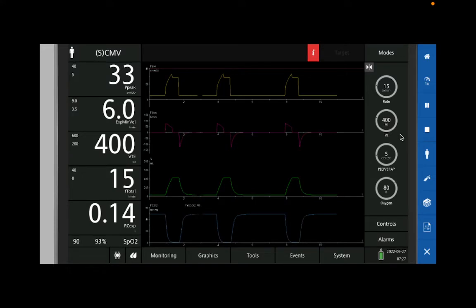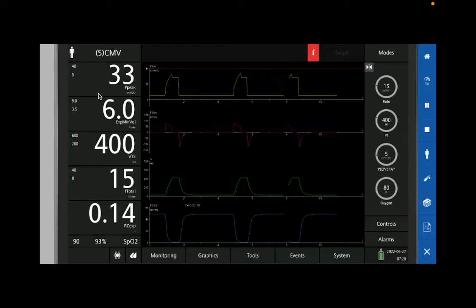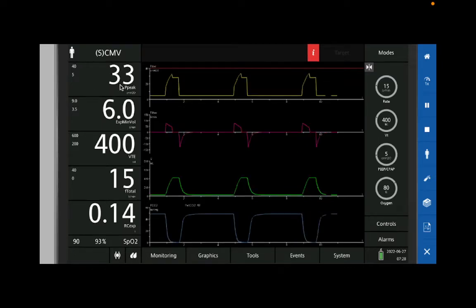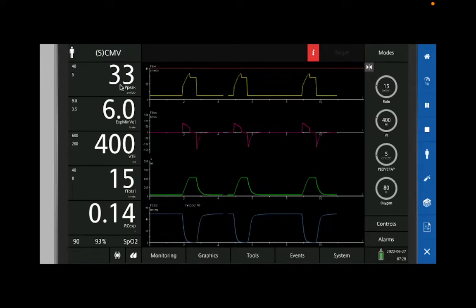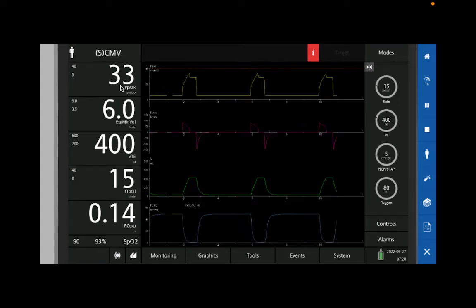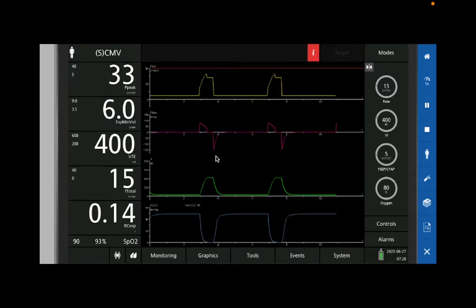So let's ask this question differently. If I have my tube that's partially kinked, and my peak pressure is 50, and my plateau pressure is 25, am I damaging those lungs? No. The pressure in the tube is super high, but my lungs aren't getting that pressure. So it's plateau pressure that we want to keep below 30, okay? A lazy way of saying that is peak below 35, because if my peak is 35 or less, my plateau is going to be less than 30, or close enough to. But it's good to know what that is. Sawa?